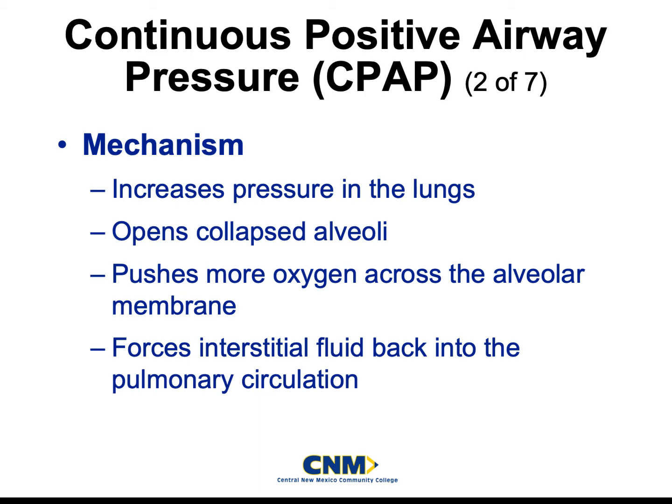It is a very subtle setting, I guess is the best way to put it, that even all vents have, the automatic transportation ventilators. This is an awesome machine. I don't want you guys to fear it. It's very loud. It's hard to hear the patient. It's definitely hard to hear the patient talk.